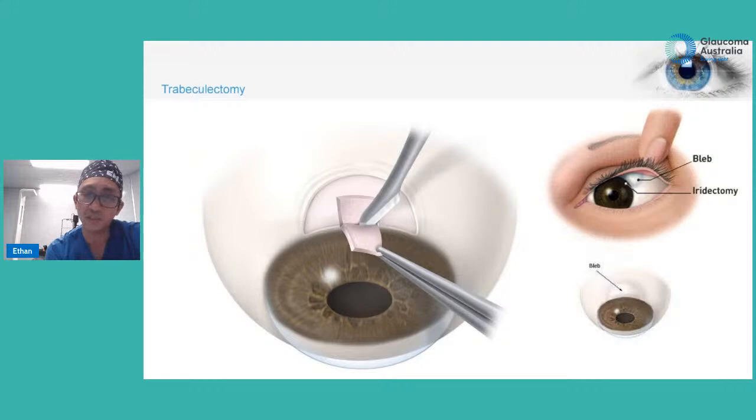And everyone does it slightly differently, but basically you can put a couple of sutures down to tighten that flap, and then you pull that clear layer, the conjunctiva, back over and close over it. And then in the next several weeks, as the eye is healing, those sutures that you'd use to close down that flap, you can either sometimes laser to break and release, or you can pull out. You can make them releasable sutures, and they're very tiny, so the patients don't feel them. They're thinner than a strand of hair on your head, and you can pull them out through the cornea in the clinic on the slit lamp through the microscope with a bit of practice. And that adjusts the tension on the valve and helps us modulate the pressure.